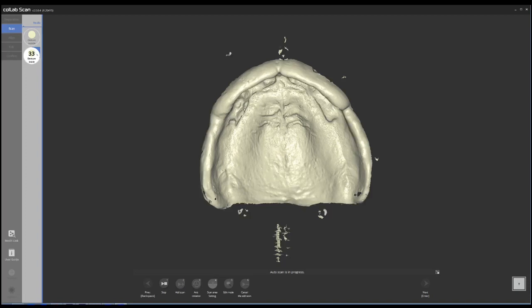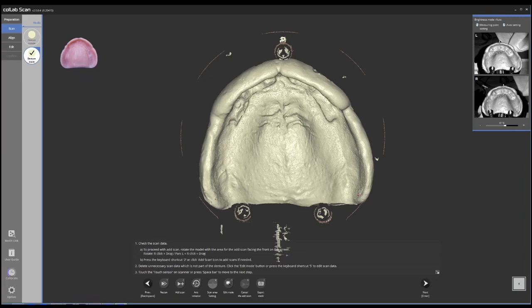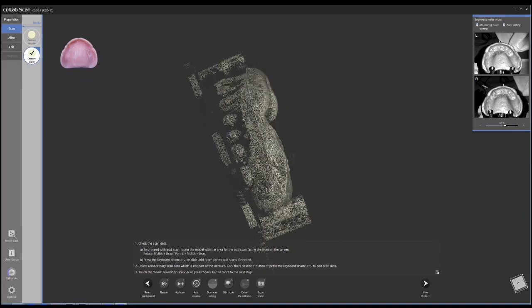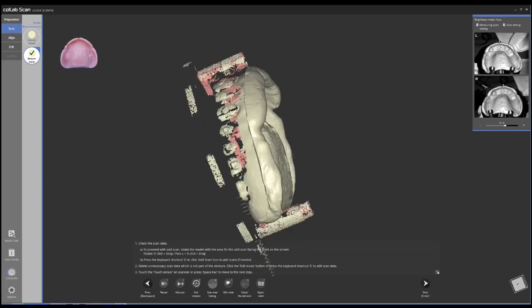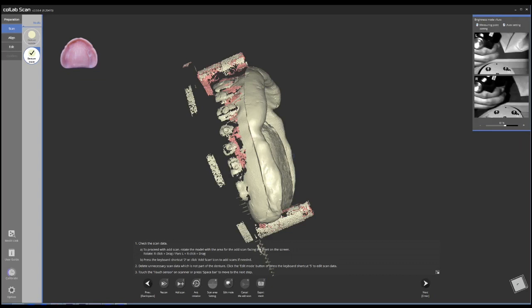The process is very automatic. You can see how the inside part of the denture gets scanned 100%. In some cases, you will have to use a little bit of spray depending on the acrylic that you're using.